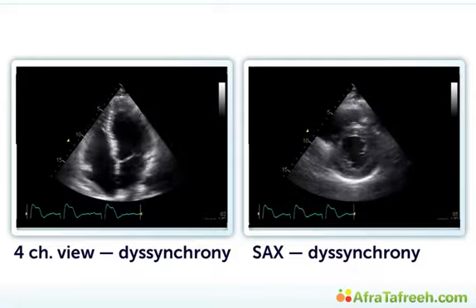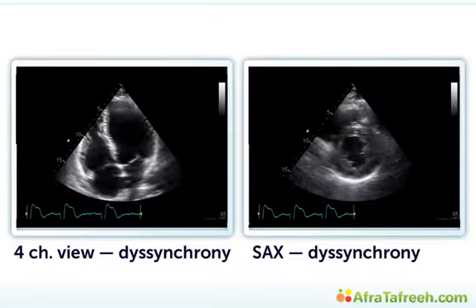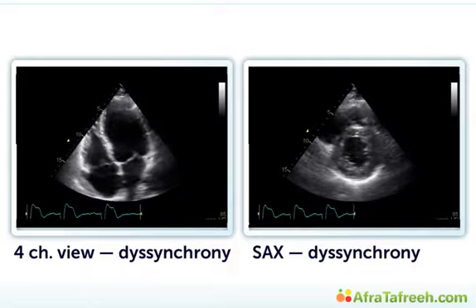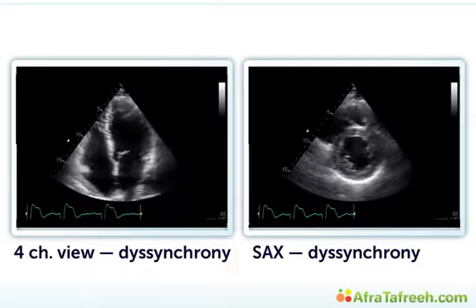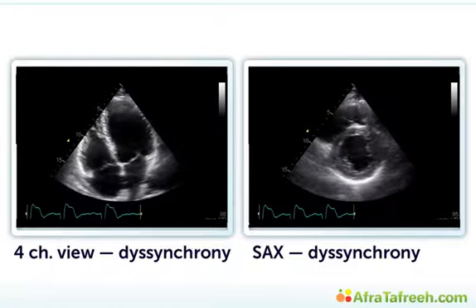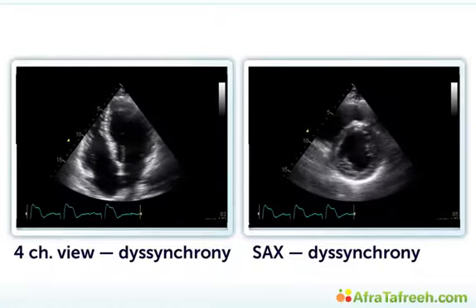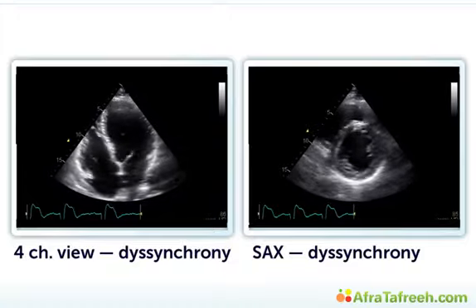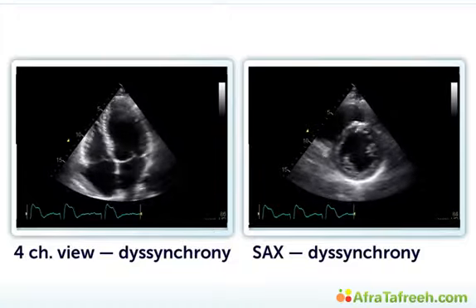Now we do not know if left bundle branch block is in reality some expression of disease in this patient, or if left bundle branch block will sooner or later lead to myocardial disease in this patient. Nevertheless, keep in mind such patients always appear to have a worse left ventricular function than they actually do.